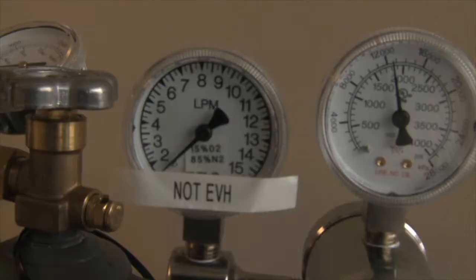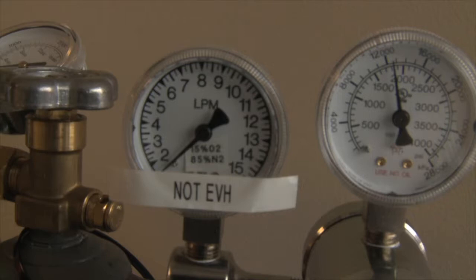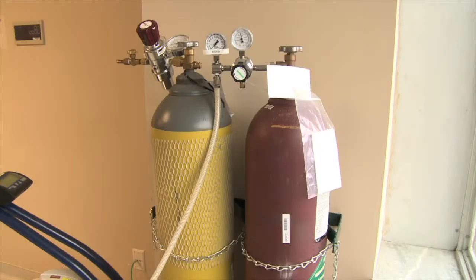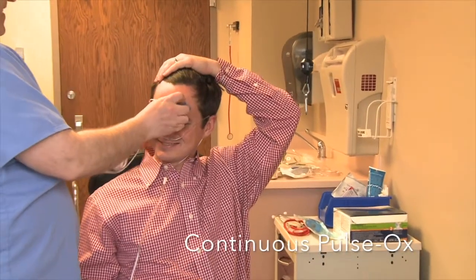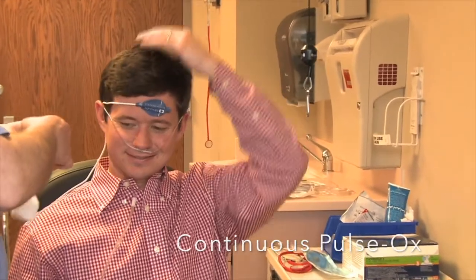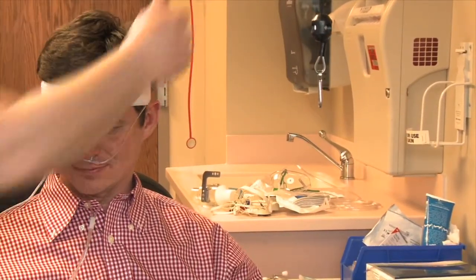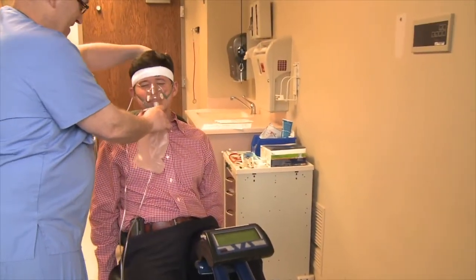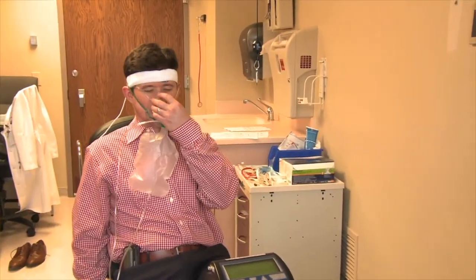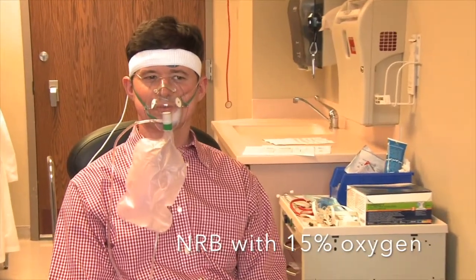To perform HAST testing, you need a gas concentration with 15% oxygen mixture. You also need a patient that will be hooked up to continuous pulse ox so that you can monitor heart rate and SpO2 throughout the testing. In addition, they need to be hooked up to a nasal cannula so you can supply supplemental oxygen if necessary. Finally, a non-rebreather with the 15% oxygen mixture will be placed over the patient's mouth.